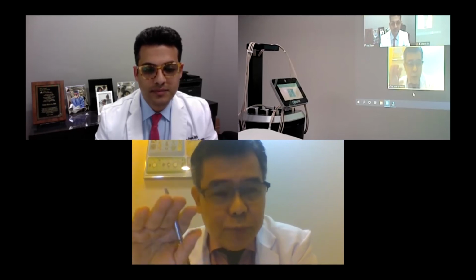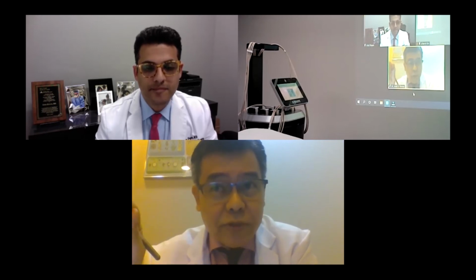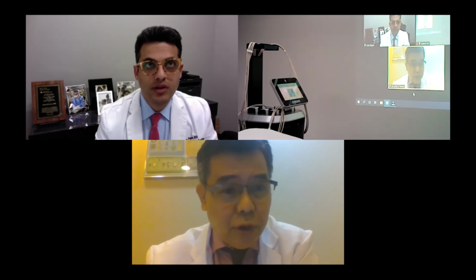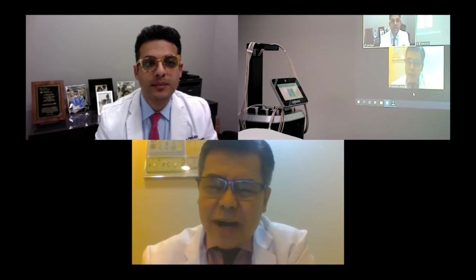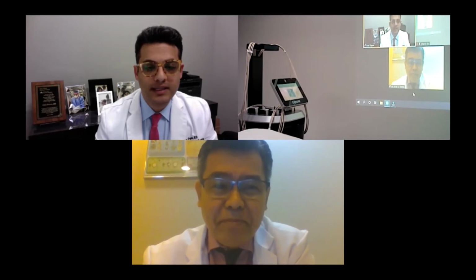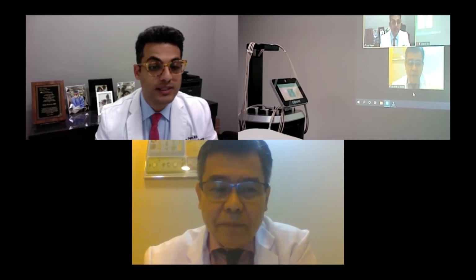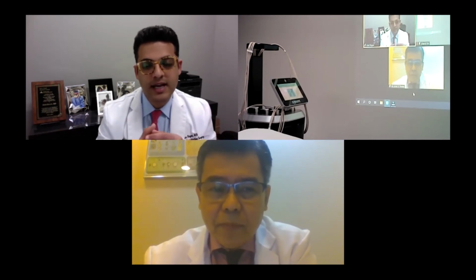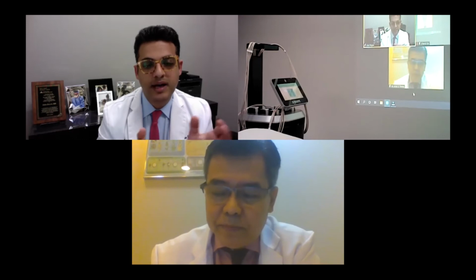Okay, so it's better to treat at 42 to 43 longer rather than at 47, 48 shorter, based on your analysis earlier? Well, I would say it depends. It's a great question. The way I look at it is, it's potentially equivalent at those differences.